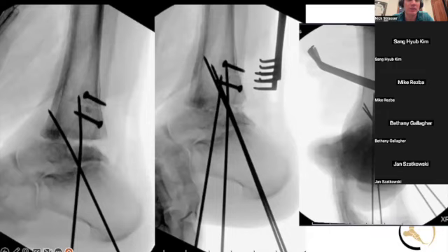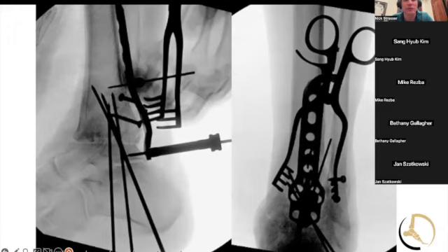I'm intrigued by this percutaneous approach, Jan. I thought about going arthroscopic on it as another option, but I'm not sure I could have gotten in there to do much. I don't think you need to go arthroscopic though, because I don't think you need to see anything. Just run the burr, because you would do this over X-ray. If you look at your CT scan that you had initially, you really didn't have any, I would say, probably very minimal to any cartilage anywhere. So I think that's how I would do it.